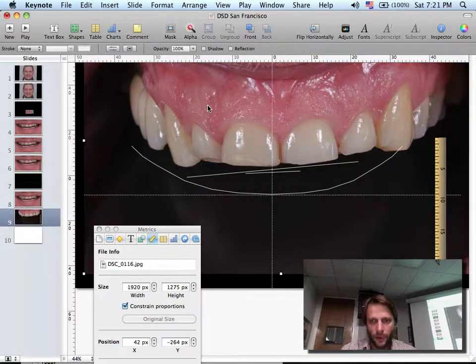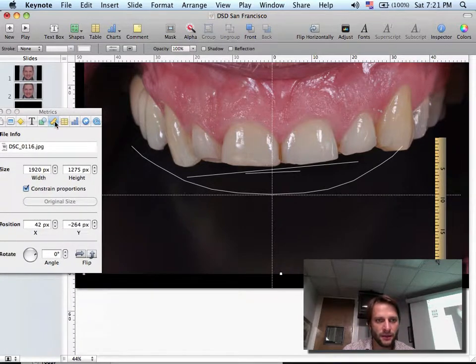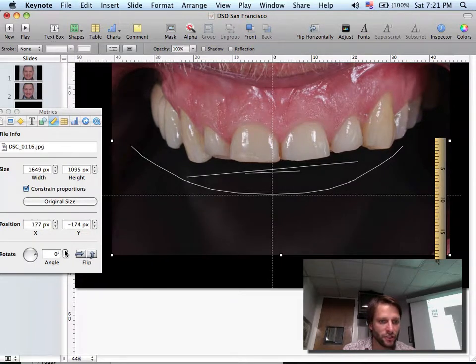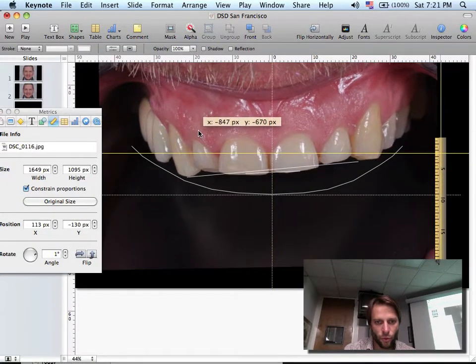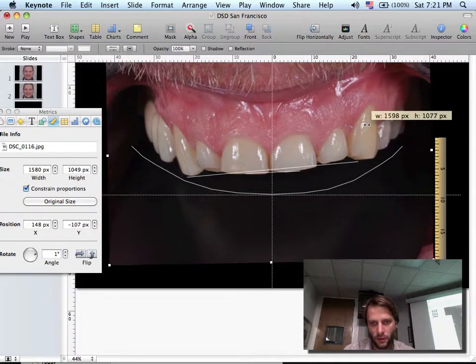So the thing is, we're gonna change the size and the canting. The size I will change with my fingers or by grabbing the little squares on the side of the picture. And the canting I will change by clicking here on these arrows up and down. So I usually put one cuspid here and then I see what's going on with the other.